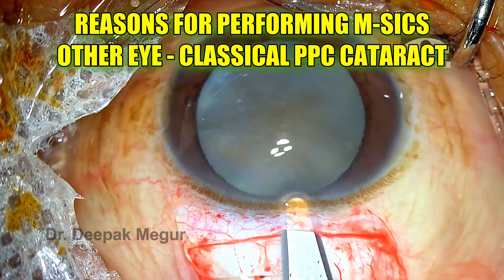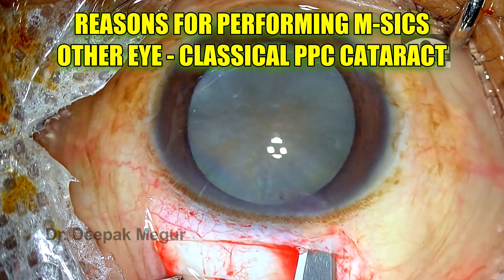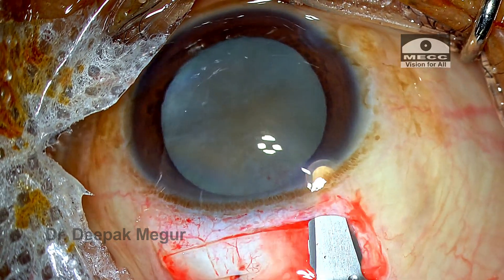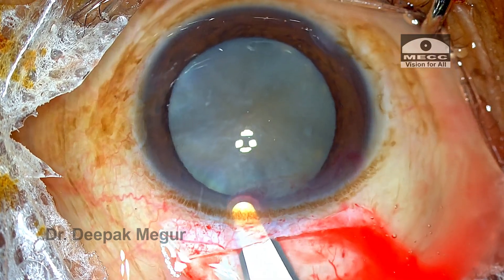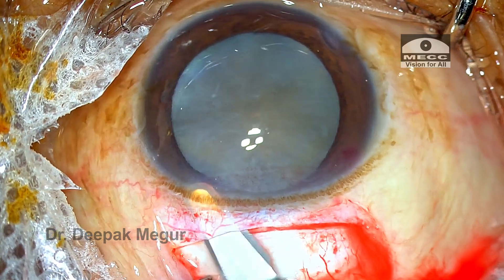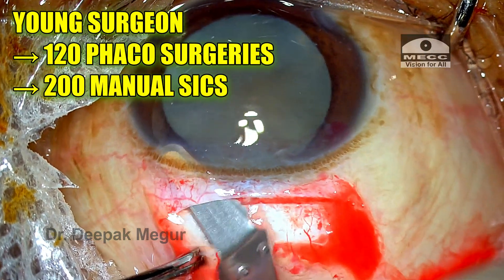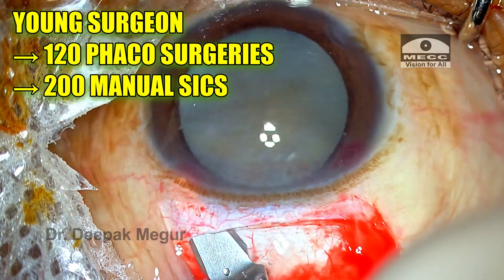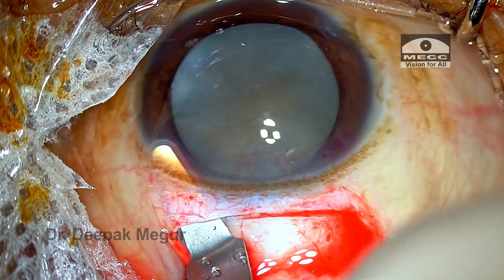The reason for performing small incision cataract surgery in this patient was that the other eye had a classical posterior polar cataract. There's always a higher chance of having an intraoperative posterior capsular tear in this eye, and it may even be present preoperatively. With this high risk in place, the surgeon decided to perform manual small incision cataract surgery. This surgeon has performed around 120 phacoemulsification procedures till now, so we're expecting her to manage the complication effectively on her own.